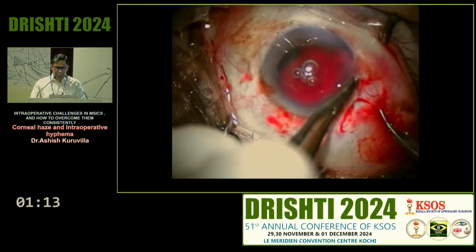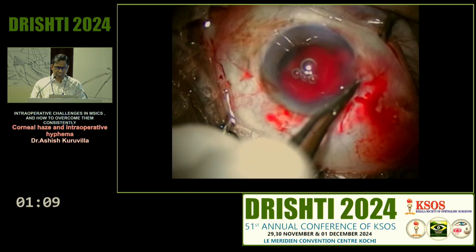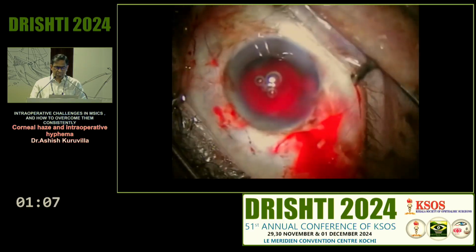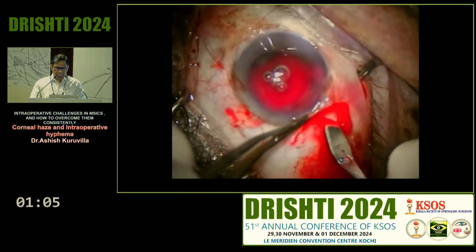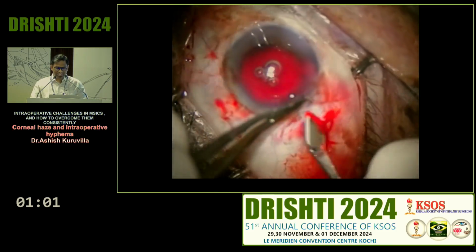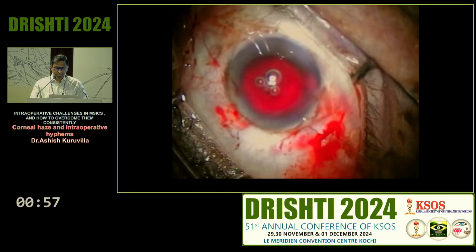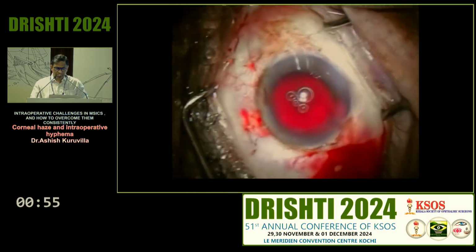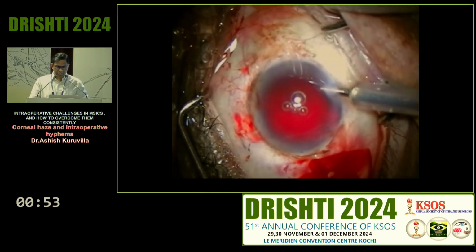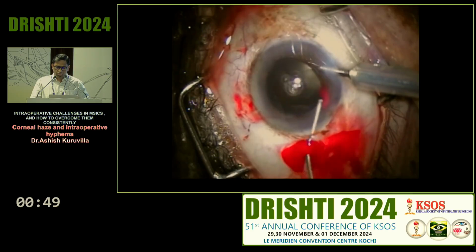It is an incision which has gone vertically backwards rather than parallel to the limbus. And that was what is causing that bleed over there. So somehow that has to be relieved, and the pressure inside the scleral pocket should be less than that of the eye. So once I make that nick over there on the side, you can see the gushing of blood coming out to the external aspect, and now it is no longer going inside.